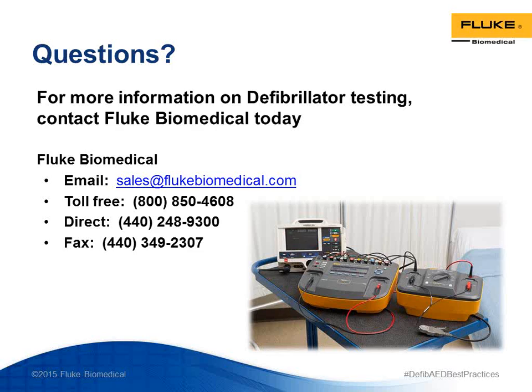So you really need to pay attention to battery maintenance and really good battery care to get the most life out of those batteries. So swapping them, making sure that they're completely charged up. We don't have time to go into that litany right now in this session. That would be a really great discussion just all by itself.